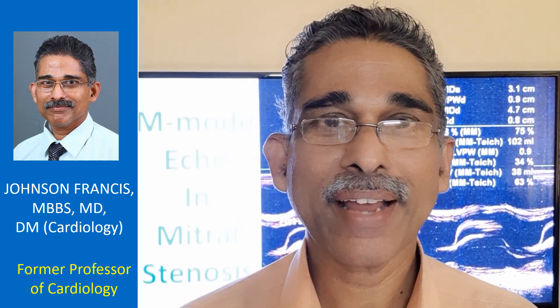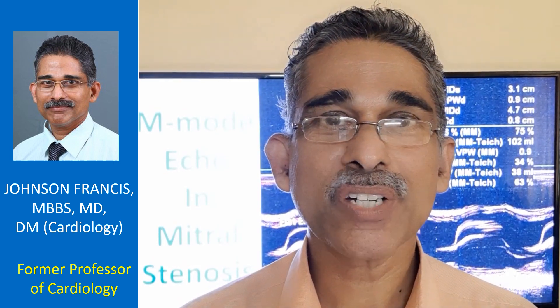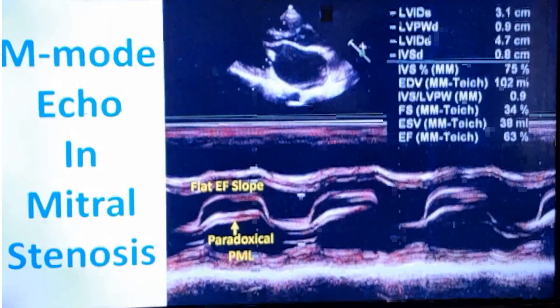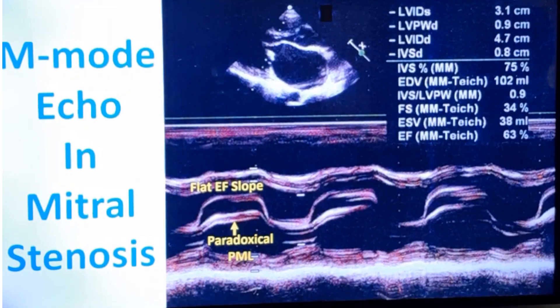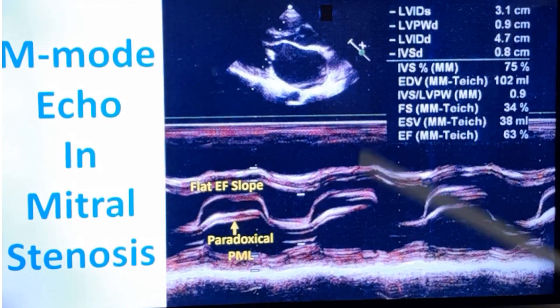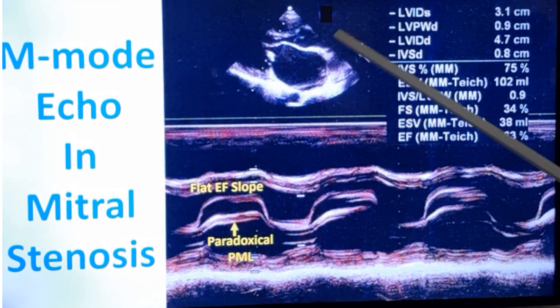I am going to discuss M-mode echocardiogram in mitral stenosis. M-mode is time-motion mode. It is a one-dimensional mode with high temporal resolution. This is the M-mode echocardiogram in mitral stenosis, guided by a two-dimensional image.